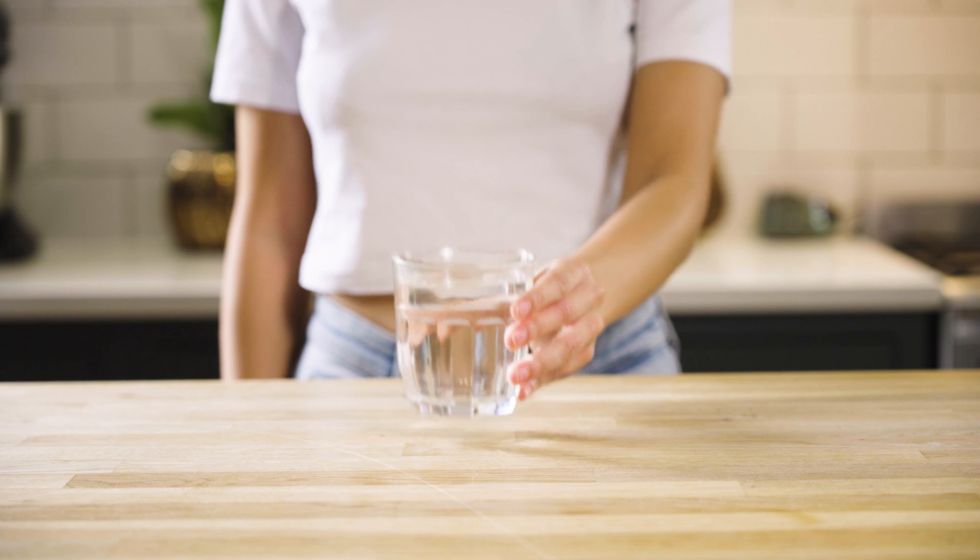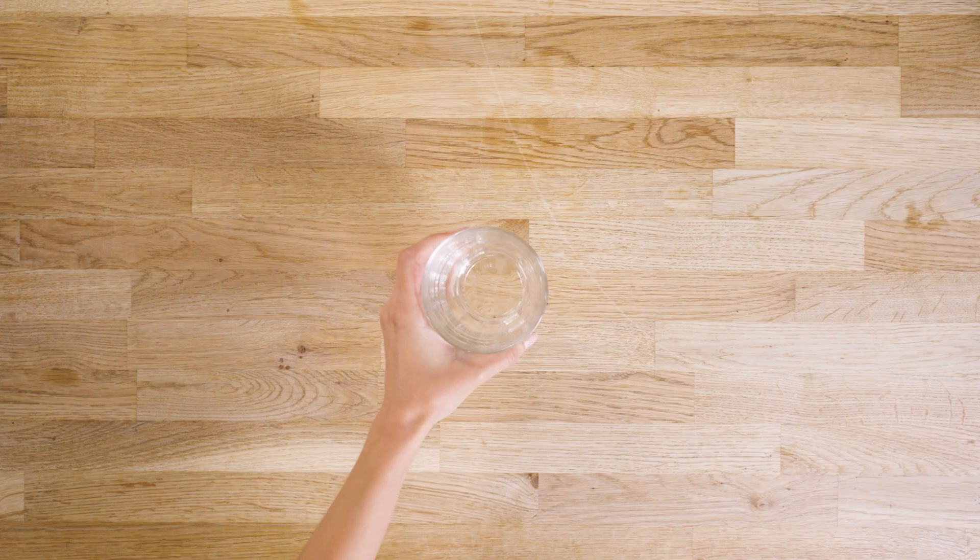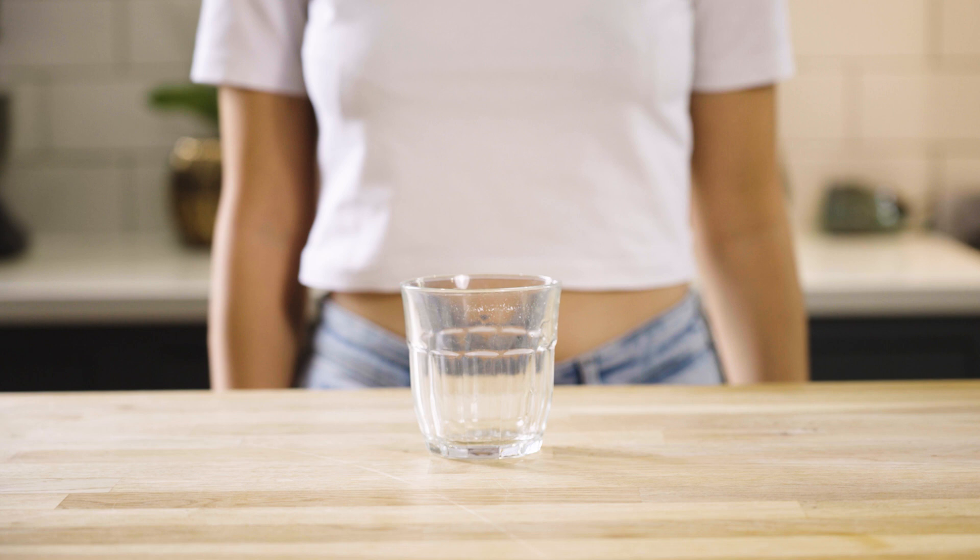30 minutes before you begin the test, drink 2 glasses of water to increase your blood flow. Once you're ready, make sure to set aside half an hour to set up and collect your sample.